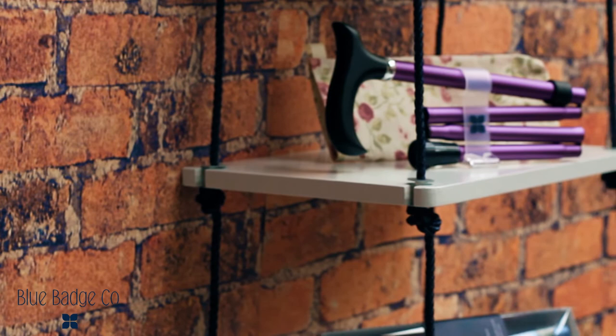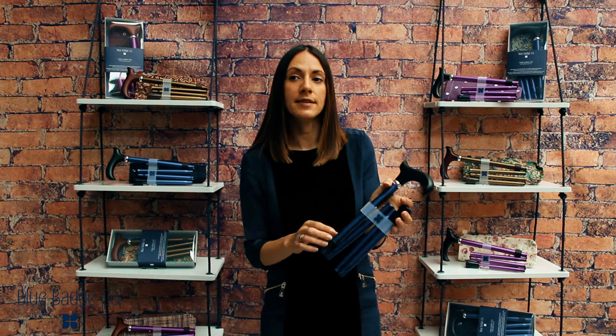Made from high quality lightweight aluminium and with a Canadian wood handle, I'm going to show you how to open, fold and adjust the sticks for easy storage and assembly. Our sticks come with a plastic brace which keeps the stick together.